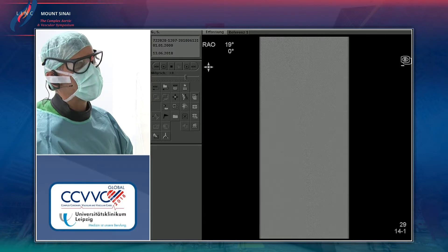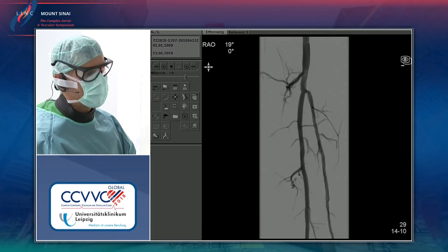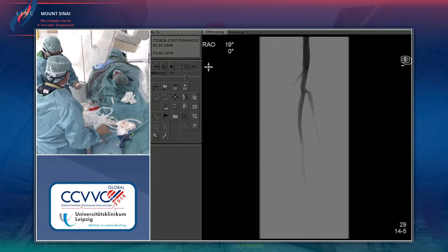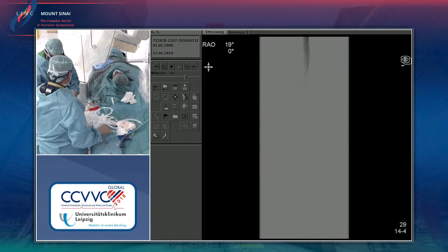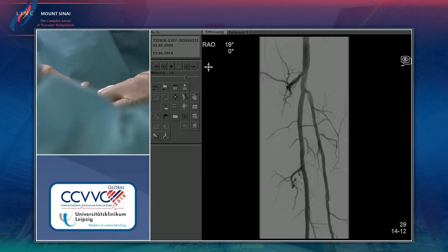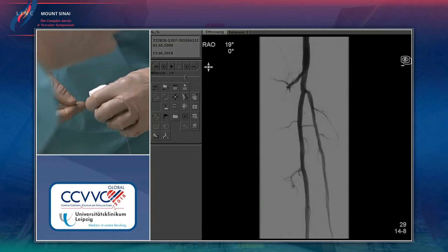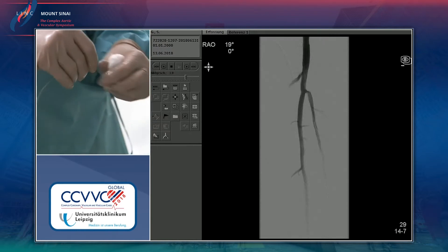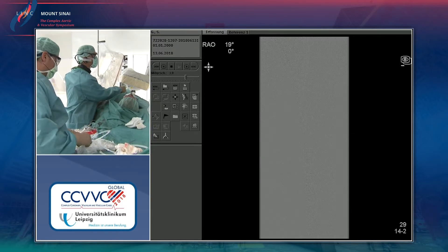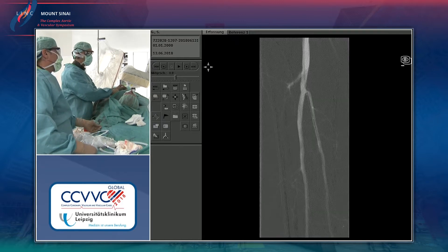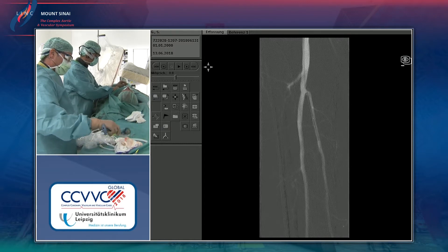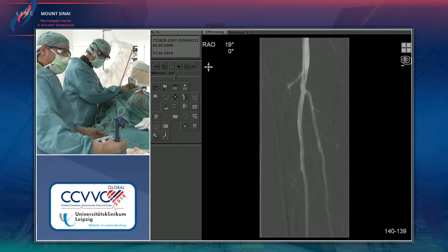This is proving to be a very resistant stenosis. A small vessel TurboHawk atherectomy device is being considered to open it, with a short stent also remaining a good option. Optimal inflow into this long subintimal re-canalization channel is essential, requiring high pressure in the new channel.